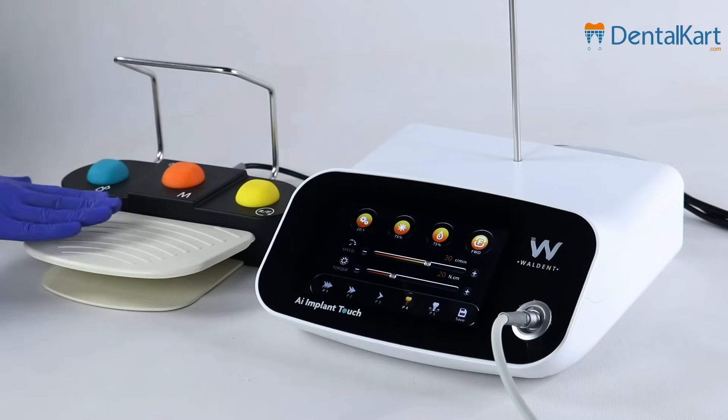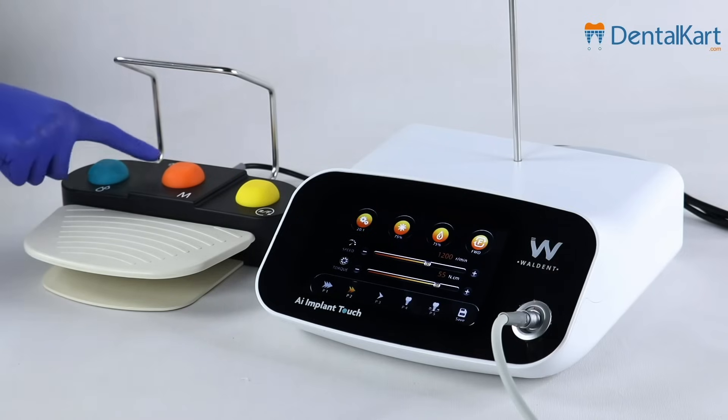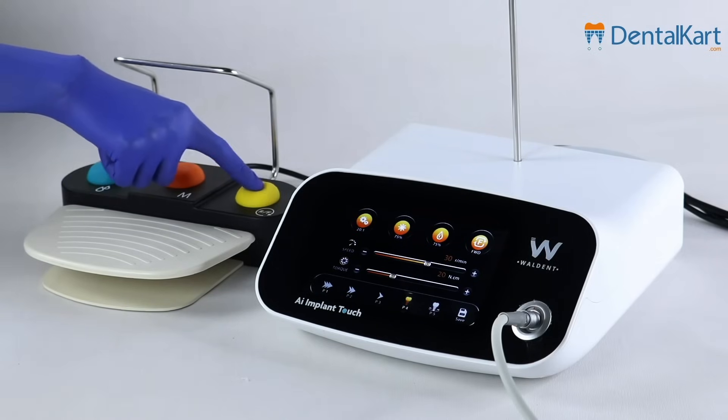Now let's come to the foot pedal. There are three buttons. The green button is for switching the water flow. The orange button is for choosing the program. The last one is for direction — if you change it to reverse, a beep beep sound will be heard.